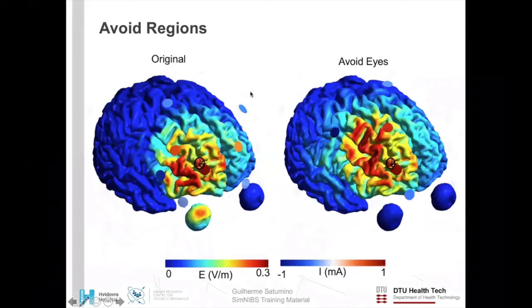SimNIBS also lets you define special positions to be avoided. Suppose you're optimizing a TACS montage to obtain electric fields in a frontal target. However, this optimized electric field has a large electric field here in the eyeballs and you don't want that because it might induce phosphenes. SimNIBS allows you to mark the eyes as a special region where fields are to be especially avoided. And when you turn that on, we can see that the simulation results change drastically to really avoid the electric field in the eyes.